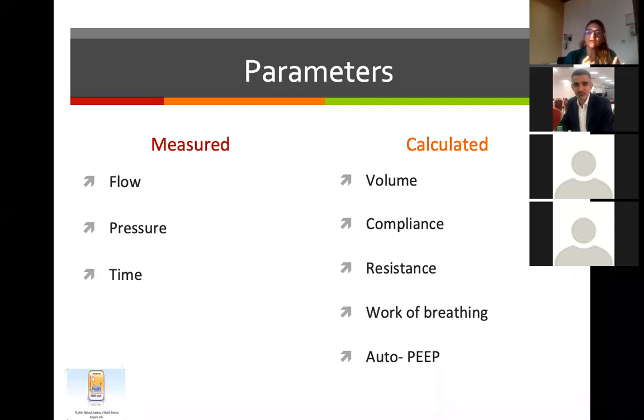Can I interrupt? Yeah. So you mean, I'm just rephrasing what you said. So you mean that the temperature change in a distance over time represents the flow? Yeah. Okay. That's what it is. Yeah.